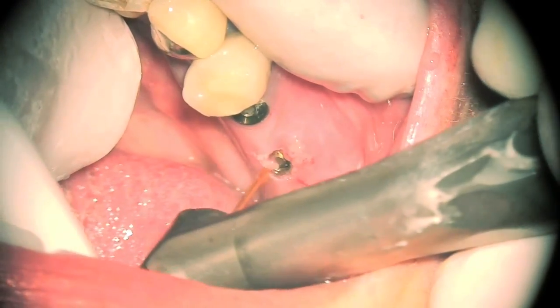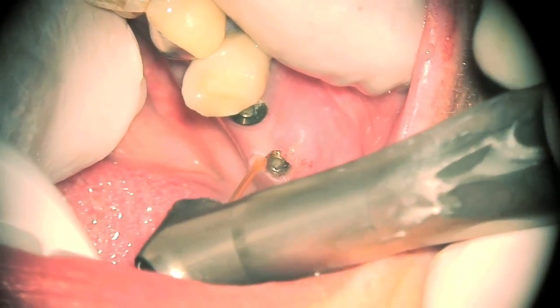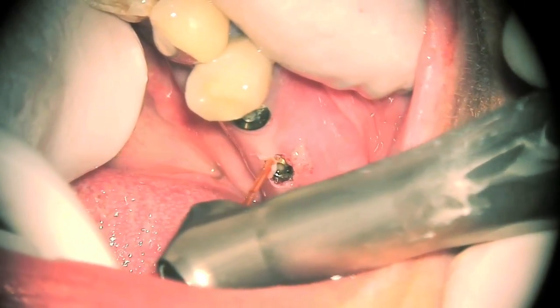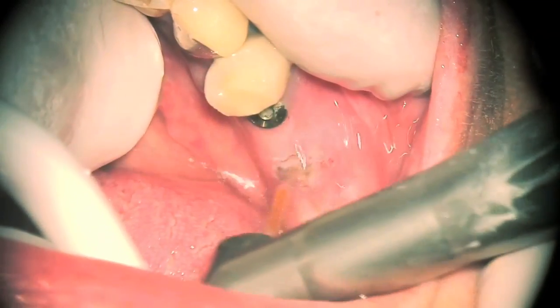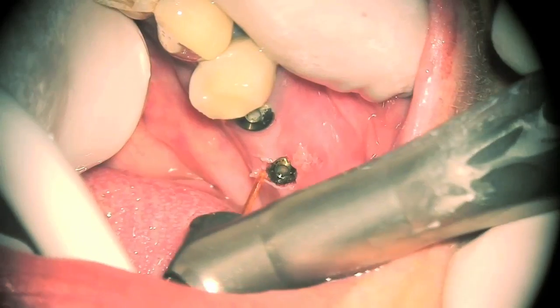You can place the abutment in. But with the laser, you can actually go through, uncover, get your emergence profile, put your abutment in, take your impression, and if you have a CEREC, place the crown all in one day. It makes it so much easier.